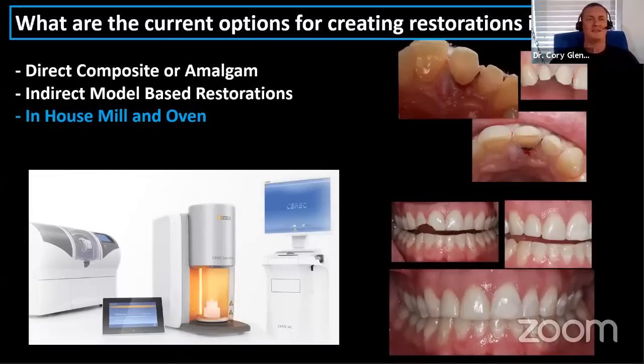And at $50,000, you've got something that, yes, you could do same day dentistry, but you are also now basically a commercial lab. You can do almost anything that walks through the door except for a full arch titanium bar. And that's just because that's the next mill up that would be able to do that. It takes a lot stronger spindle.